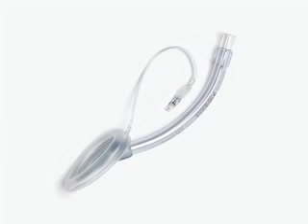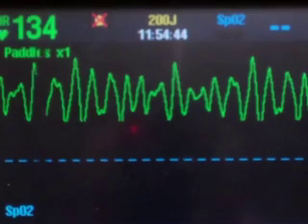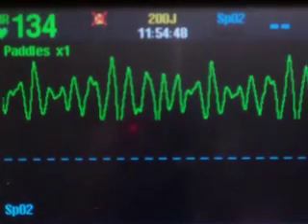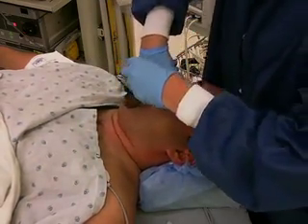The laryngeal mask airway provides a fast and effective alternative to tracheal intubation and is used for an increasing number of clinical indications, including ventilation during cardiopulmonary arrest. Laryngeal mask airway placement is usually successful in the initial attempt. Thus, it is an important procedure to learn and practice.